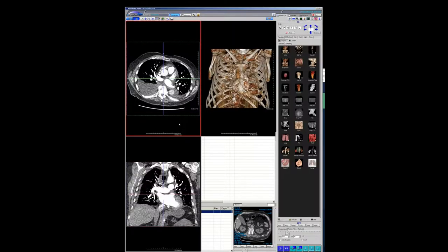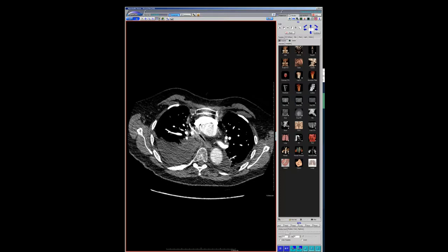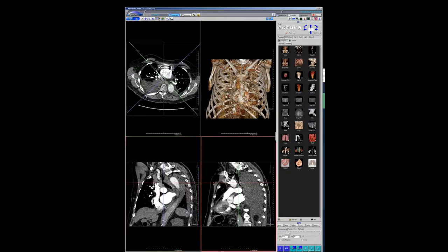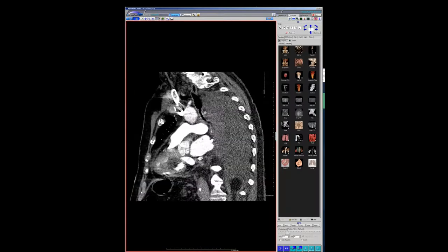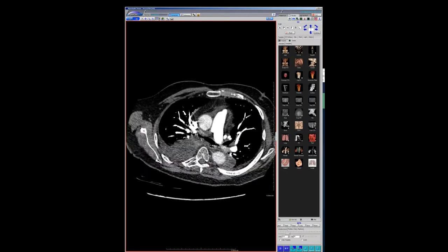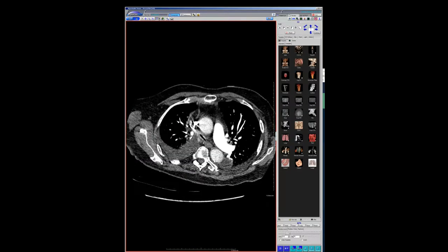So this has now been persistent over multiple CTs. I think we've all seen some degree of tracheal stenosis due to radiation. That's probably some of the worst radiation-induced tracheal stenosis that I've seen. Not super exciting, not EVALI, but a very symptomatic radiation-induced tracheal stenosis, and even the right mainstem bronchus is pretty narrow. How long ago was the radiation? Is this acute swelling or actual scarring at this point? It's scarred. This has been unchanged for about a year. His radiation was at the end of 2016, early 2017, and in 2018 he had a PET, which shows that it's scarred down and unchanged. So that's been like that.